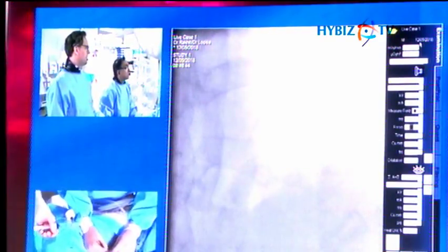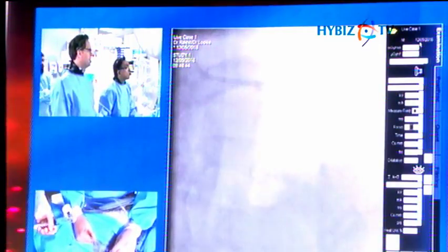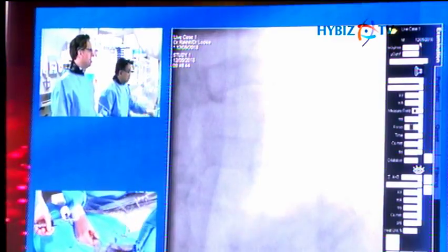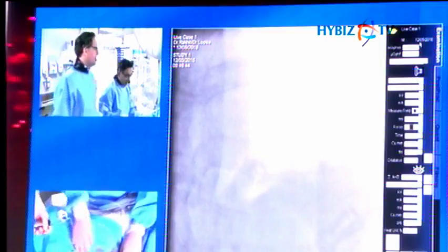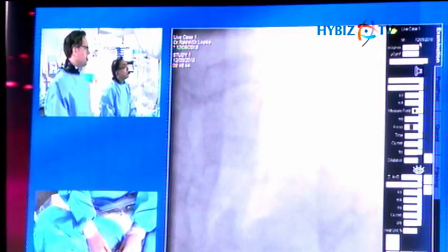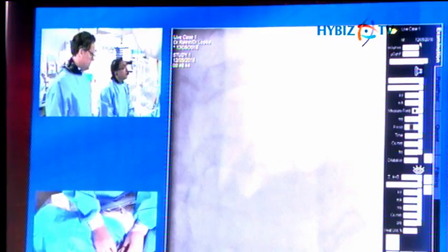Obviously the balloon is quite big and quite viscous, so we just need to give it lots of nice time. That's it. And the stent's actually got markers on it, so you can see the proximal and distal edges. What we'll do is we'll mag up and show you the sheath in my hand and outwards. I had to put a reasonable amount of traction with my left hand on the guide, just to ensure.